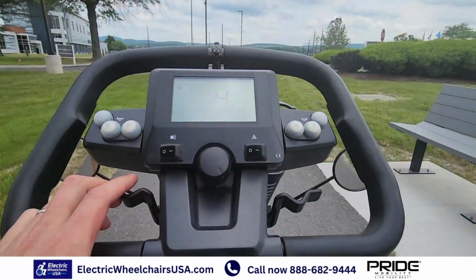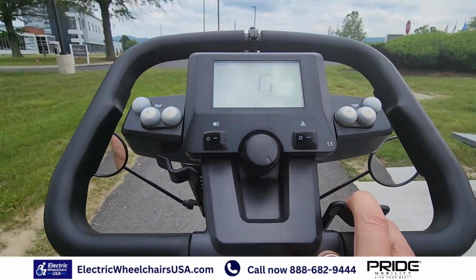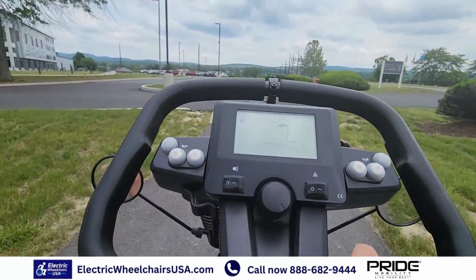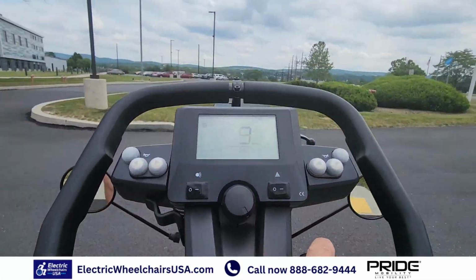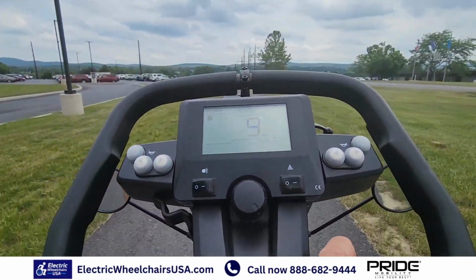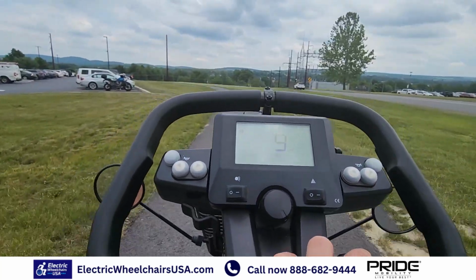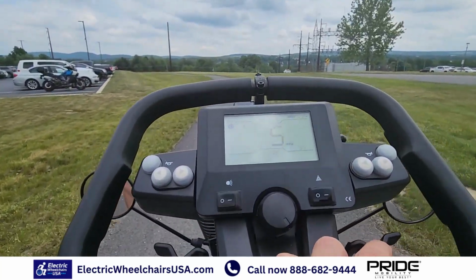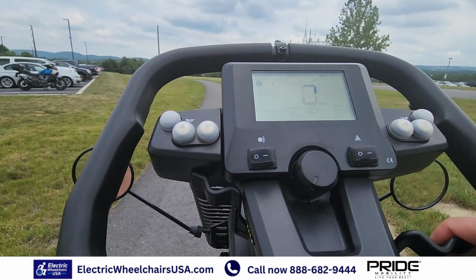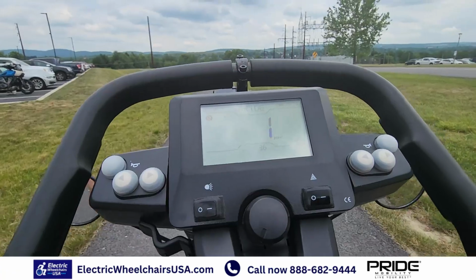A couple other things about the controls. This is your speed control dial. It tells you how fast you're going. So right now we have it on the top speed, or top setting, I should say. But say you're riding around crowds of people and you wanted to be careful and not hit someone, you might want to turn the speed setting down. So I'll put it on the lowest setting, just to give you an example. So I have it in the lowest setting, and we're at basically a crawl, 1 mile per hour.